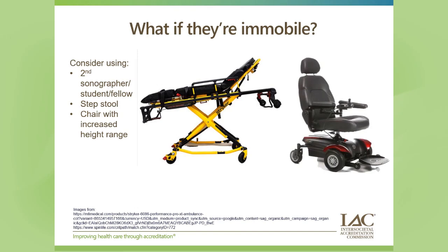So do you get a second sonographer or a student or a fellow or someone to help you, someone who can hold the probe and another person who can run the machine? If you think about the time it would take for you to struggle through that exam versus two people, it's probably worth the cost to have the two of you get it done in half the time than one of you to struggle for minimally the time for one exam, if not possibly more.